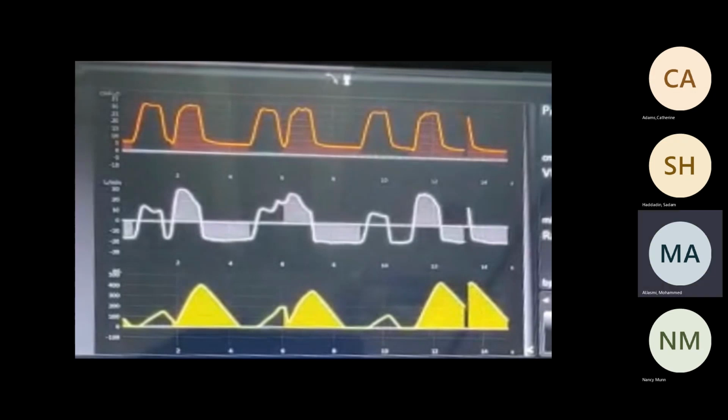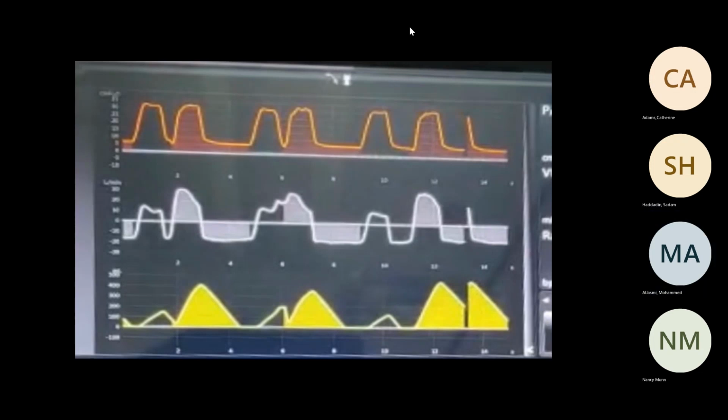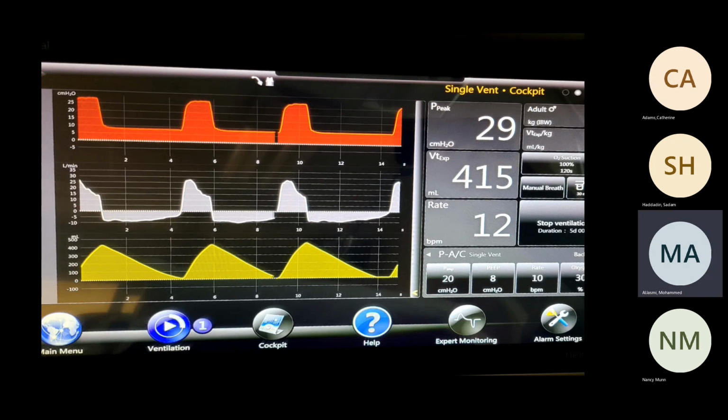He told me to do something, is that right? Accept, or just click on that toolbar. You have to call for help. All right. Here, he reduced the rate to 12. So all of the breaths were by the patient.